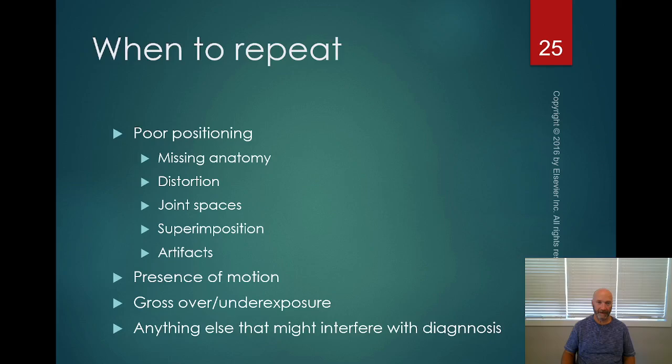If anatomy is missing that's pertinent to the exam, then you need to repeat the exam. If you have distortion that could interfere with the diagnosis, again, you need to repeat. If joint spaces need to be open and they're closed, then you need to repeat.